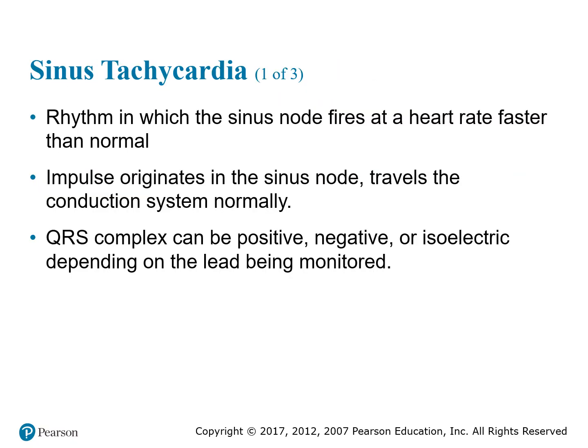All right, just the opposite, sinus tach, T-A-C-H-Y. Tachy is anything fast, right? So sinus tachycardia, which means that this is originating from the sinus node, is going to have a rate greater than 100. It's a rhythm in which the sinus node fires at a heart rate faster than normal. Impulses originate from the sinus node and travel the conduction system normally.